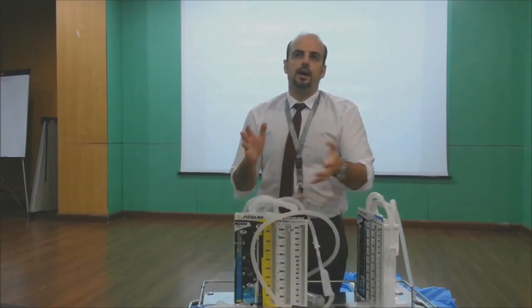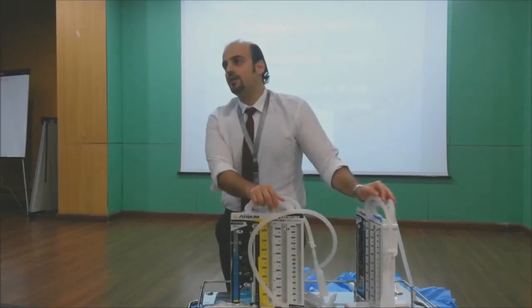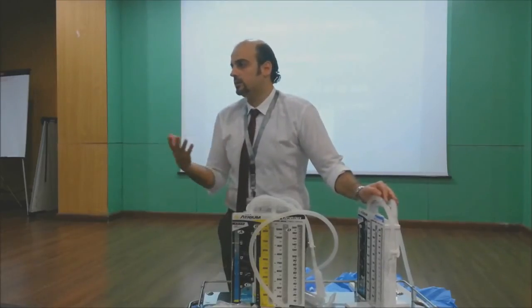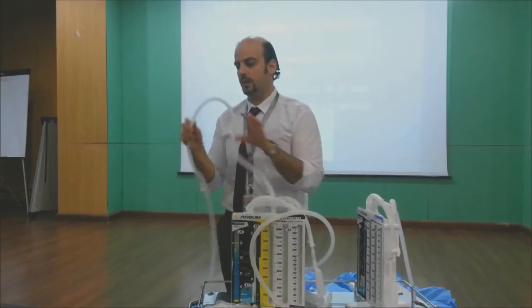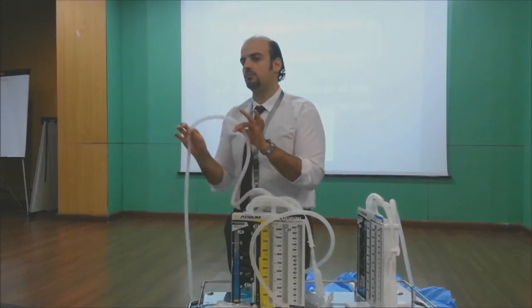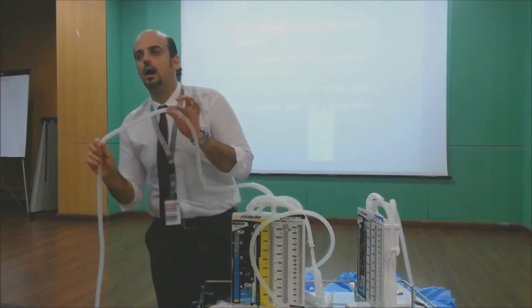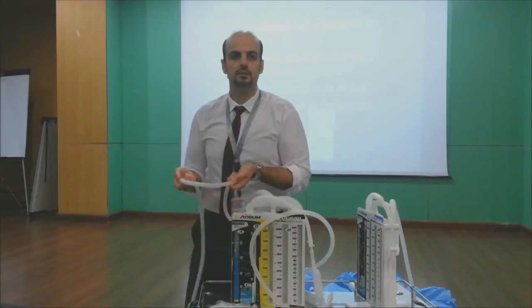Negative suction has some advantages and some disadvantages. Some of the advantages: imagine the lung is wounded, a 5 centimeter wound, and imagine the drain has a capacity of 5 liters per minute, and the amount of air going out from the lung is 7 liters.